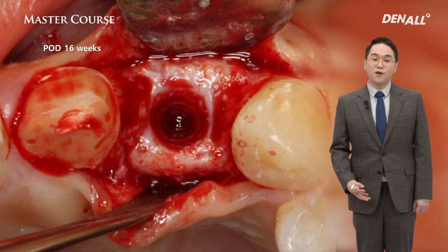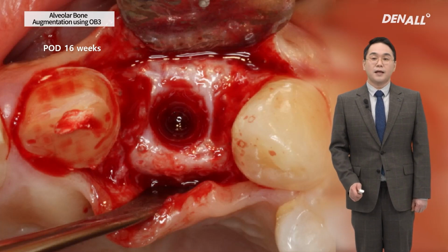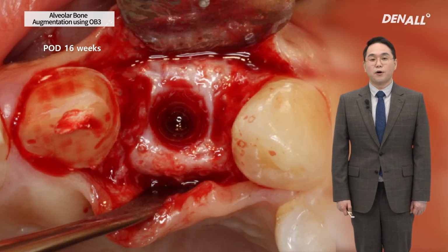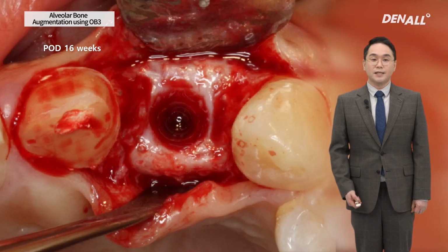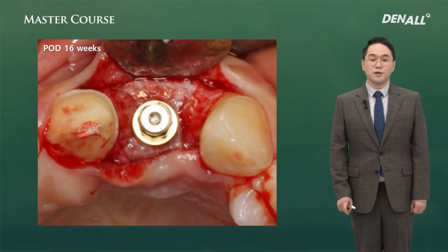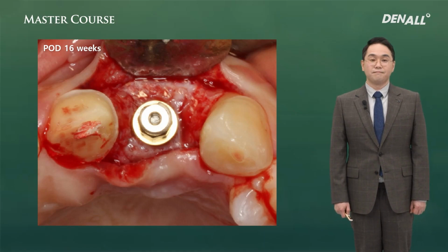Jawbuilder is removed and the ideal bone is regenerated below. In the form of the Jawbuilder, the tenting screw can be easily removed as it has the machined surface. After removing the tenting screw, additional drilling is done to place an implant.